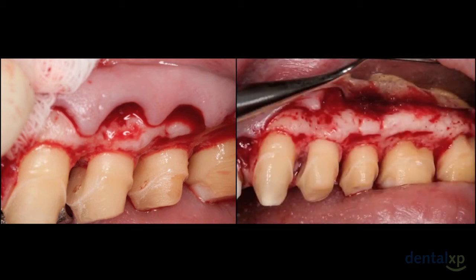In this case, we have significant amounts of exostosis that you can clearly see. It ranges from 3 to 5 millimeters in a buccal direction. We're going to have to contour all that bone away. Why? Because the flap must go over that bone that's present, thus being in more of a coronal position than it should be on the tooth surface. We want to create an environment, again, where the bone mimics the soft tissue and the soft tissue can lay closely adapted to the tooth surface.